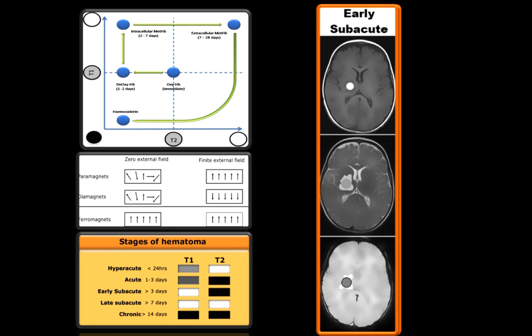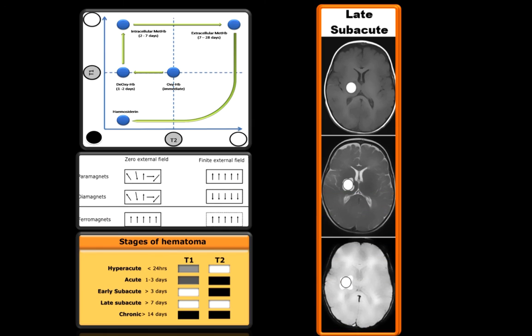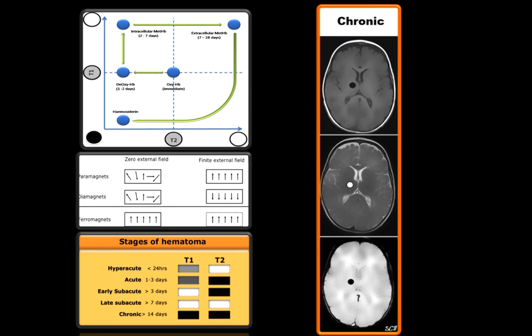Because methemoglobin is still inside the cell and not extracellular, only T1 will be affected and T2 will be hypo to isointense. In late subacute, methemoglobin comes outside the cell and is influenced in both T1 and T2, becoming hyperintense in both. In chronic stage, it is hypointense in T1 and hypointense in T2, corresponding to the ferromagnetic substance. Next, we will discuss how to locate a lesion.